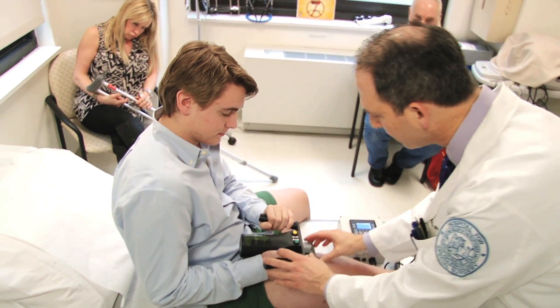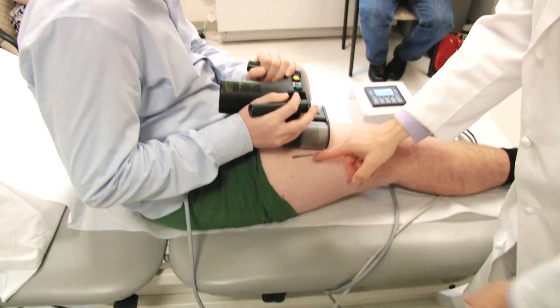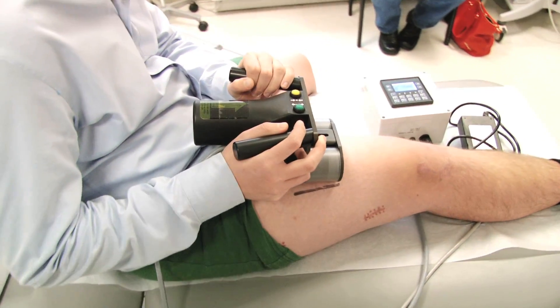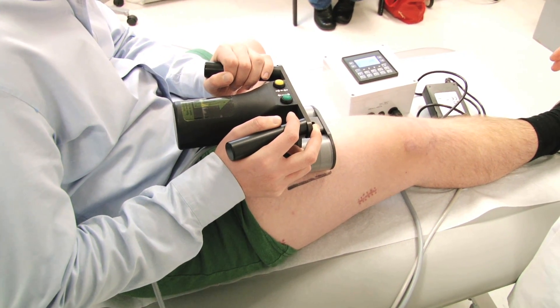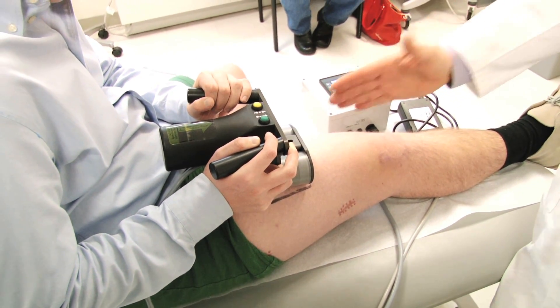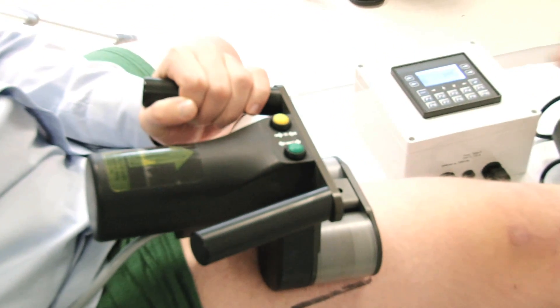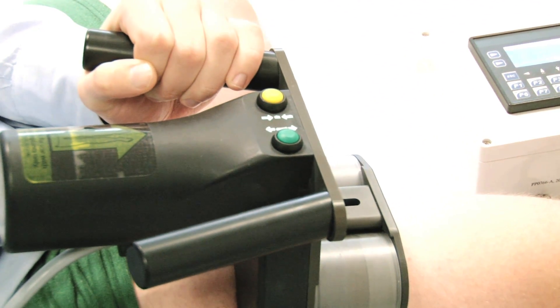The magnet is basically centered directly over that spot. I made this little mark on your skin so that you know exactly how to hold it. It's important that the magnet is oriented down towards the feet — always oriented down towards the feet. The other thing that's really important is you don't want to have the magnet askew or pointing in an off direction. It should be collinear with the leg because the magnet will interact best in that direction.